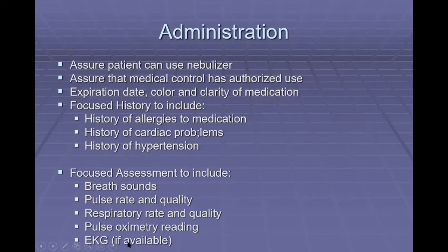All right, if we have the mouthpiece, they should be able to hold it up and take those breaths in as necessary. And we make sure that medical control has authorized use. Only do these procedures if you have been authorized by your medical control director. It's per your protocol. Make sure that it's okay at your local service to use these medications.